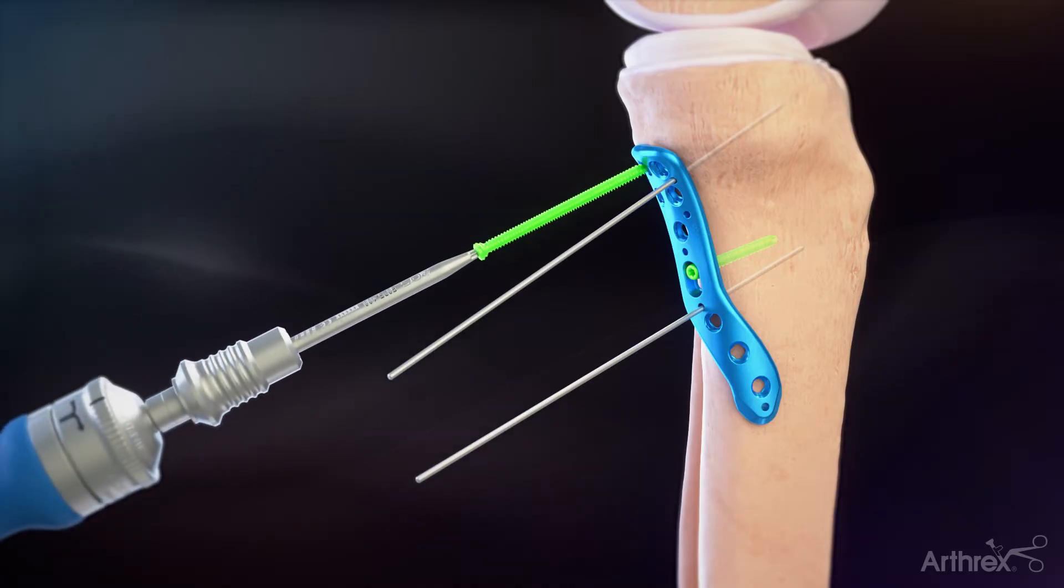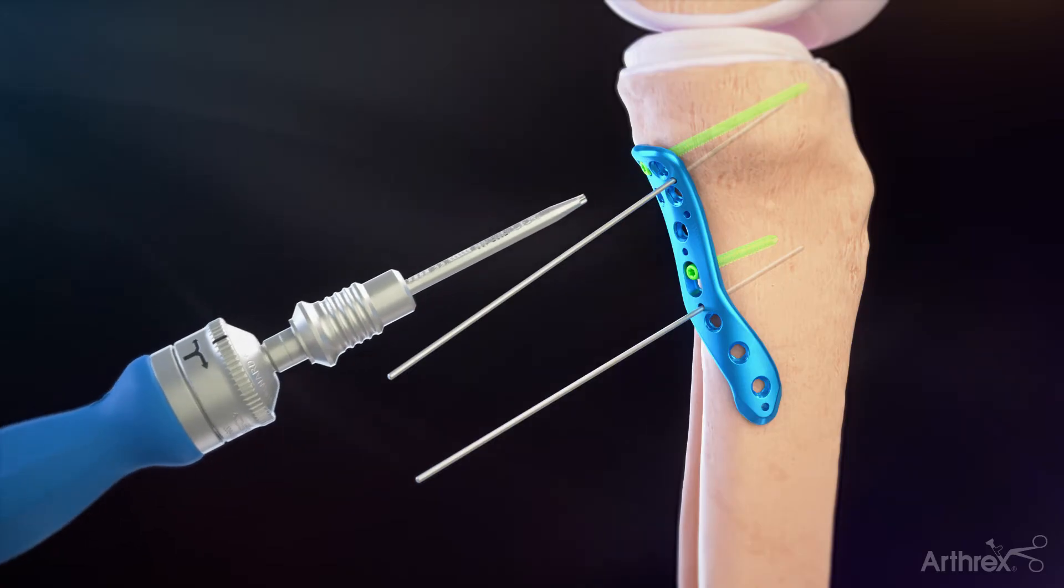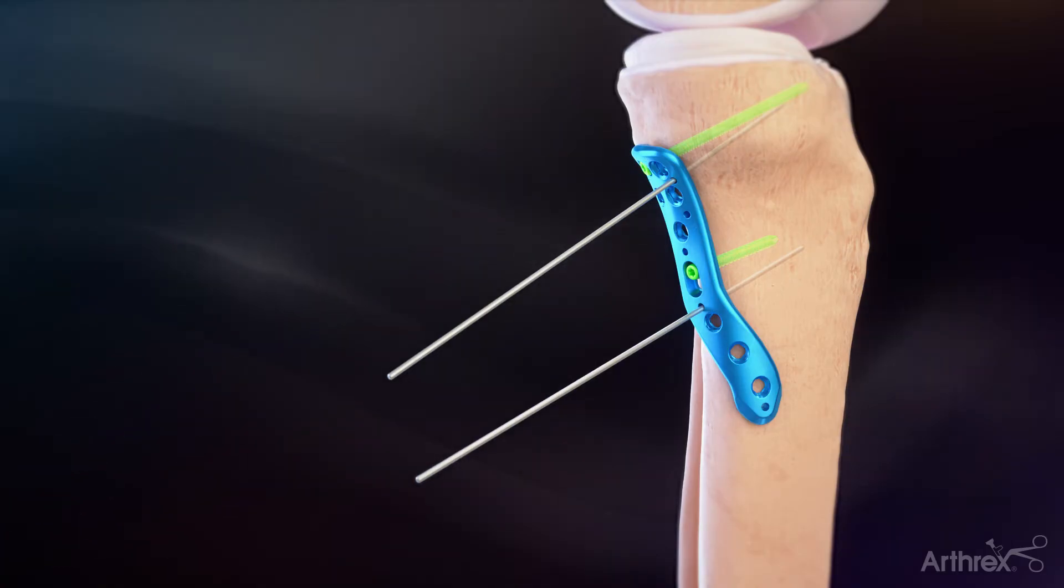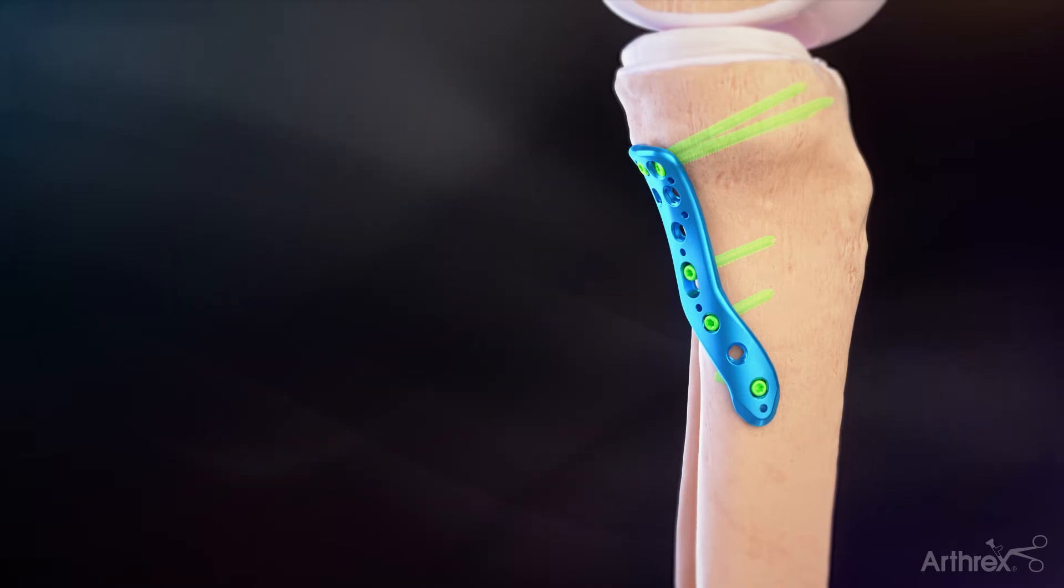Insert the selected screw on a T10 driver. The AO ratcheting torque limiting handle or AO powered torque limiting adapter is recommended for the locking screws. Add additional screws as necessary.